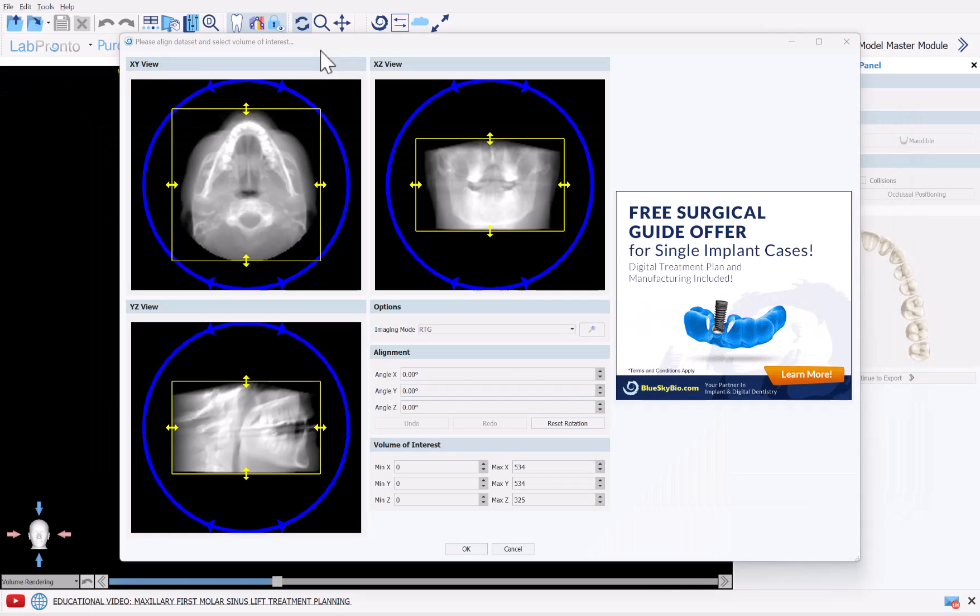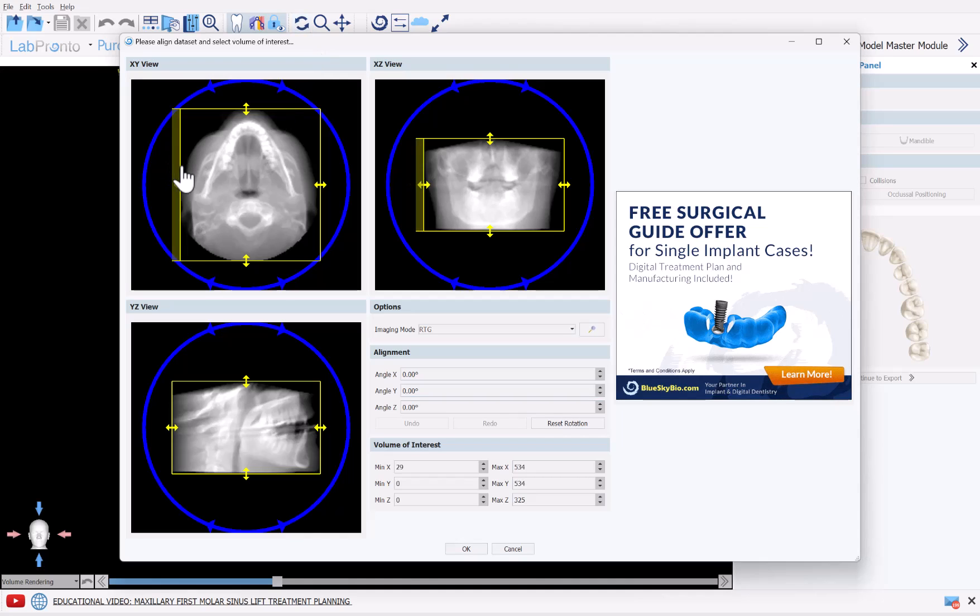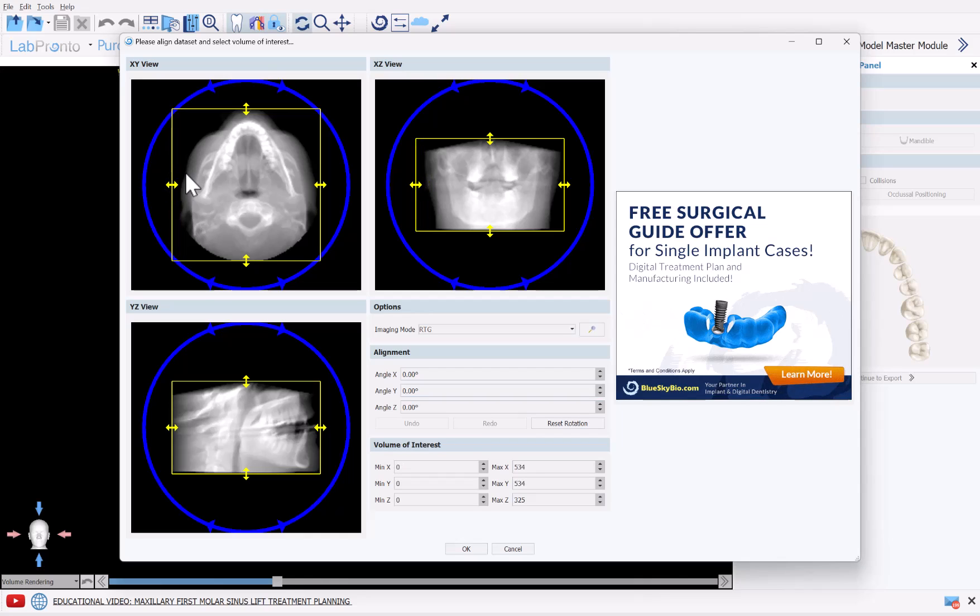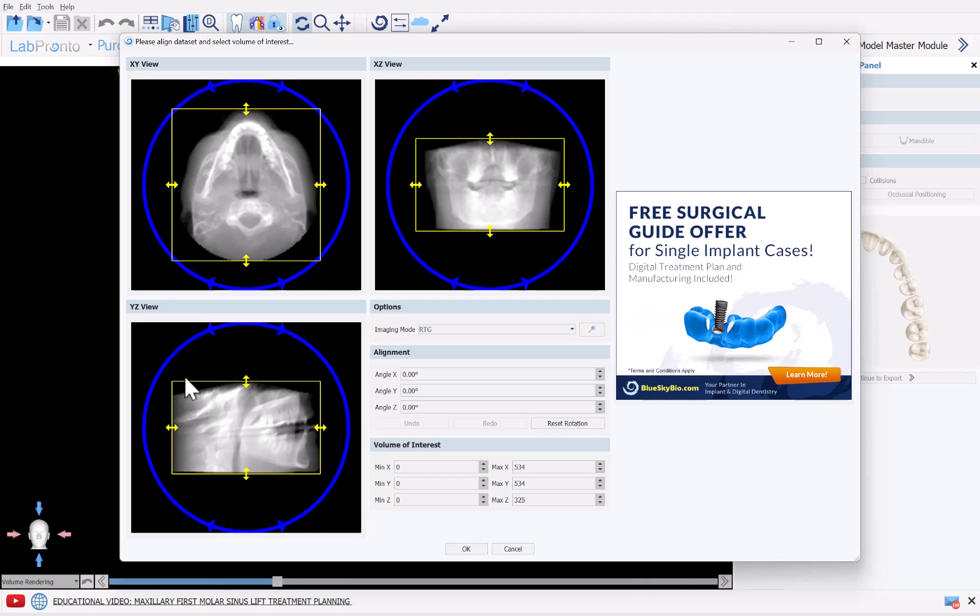Now we're going to identify the relevant field of view. You could simply grab with your left mouse button and drag any of the yellow borders to define the relevant field of view. We now have completely automatic airway segmentation in BlueSky Plan as well. So if you'd like to keep the airway included for segmentation, keep that in mind when selecting the relevant field of view and then click OK.